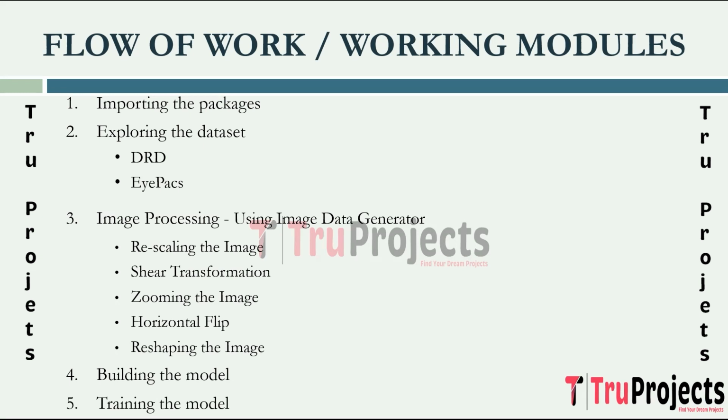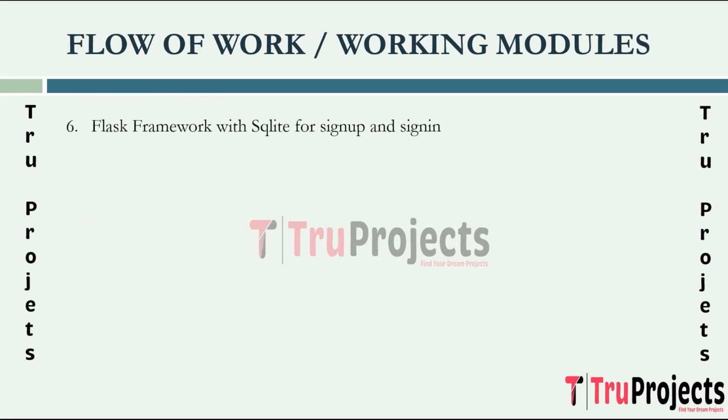This step aims to make the model capable of accurately predicting diabetic retinopathy severity levels. Coming to the next step, which is Flask framework with SQLite for sign up and sign in. Flask, a web framework for Python, is utilized in conjunction with SQLite for user authentication. This step involves setting up user sign up and sign in functionalities, ensuring secure and controlled access to the image analysis tool.